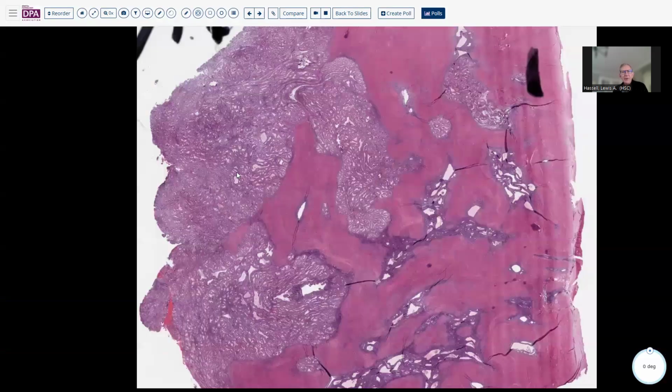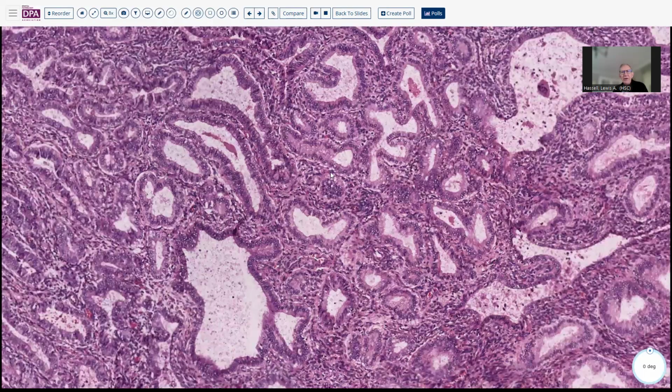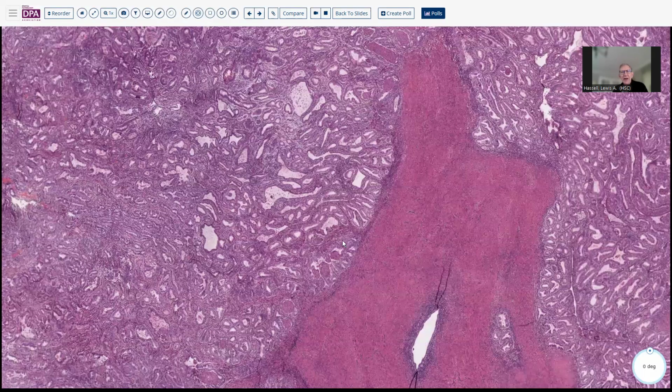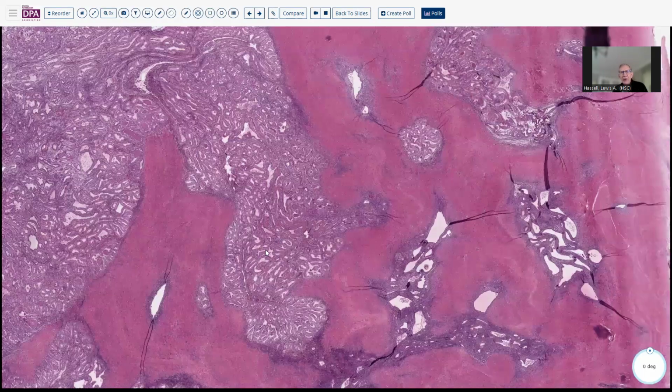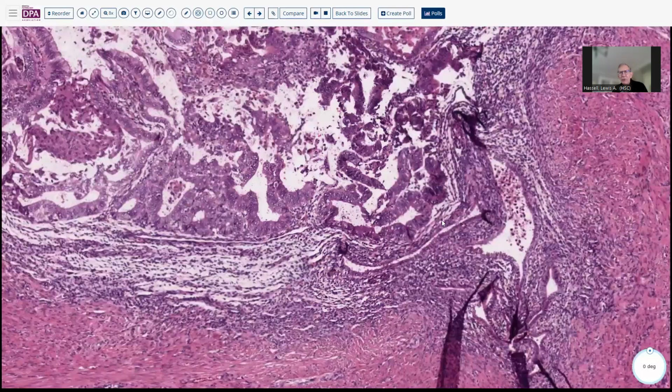here in a hysterectomy specimen, again, a case which we've talked about in some detail before. Here you see the glands are not entirely back to back. There is a little bit of intervening stroma, but again, we have the tumor diathesis in the lumen, and we have areas of morular metaplasia. Now, this has the appearance of being an invasive tumor, but in fact, as we look at each of these areas, we will see that there are oftentimes a few residual benign glands, such as you see right here.